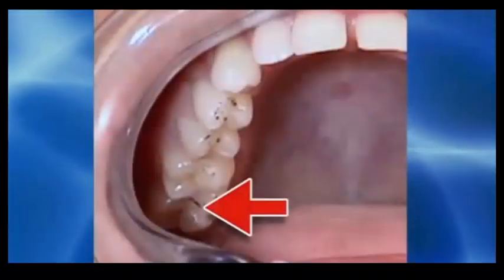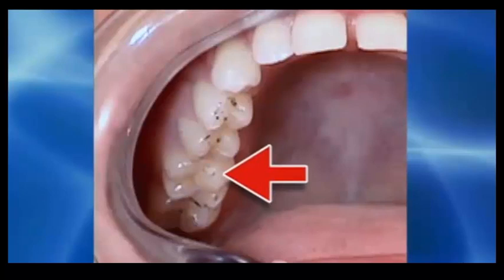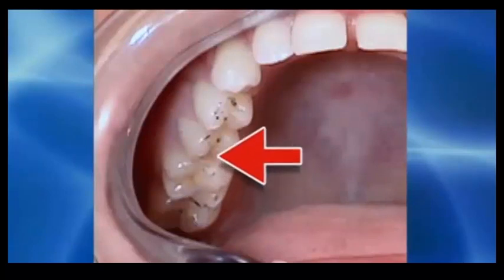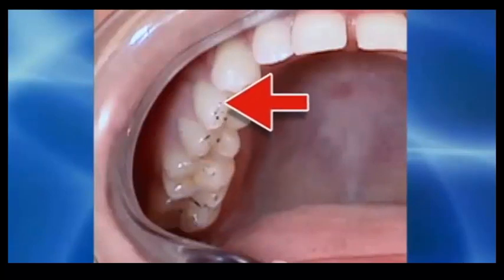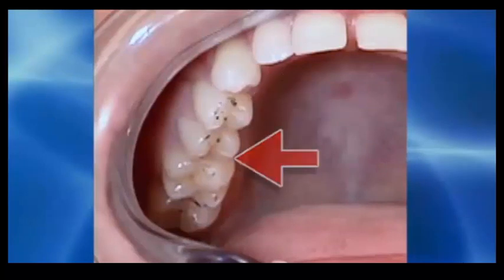On the opposing teeth, you can see the balancing inclines present on the second molar and on the first molar, both on the mesial and the distal. There's group function contacts coming towards the buccal on both premolars and on the lingual of the second premolar.